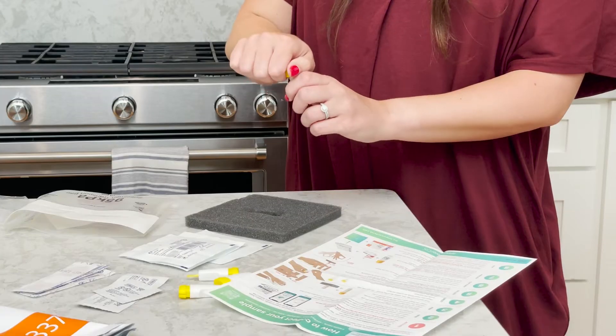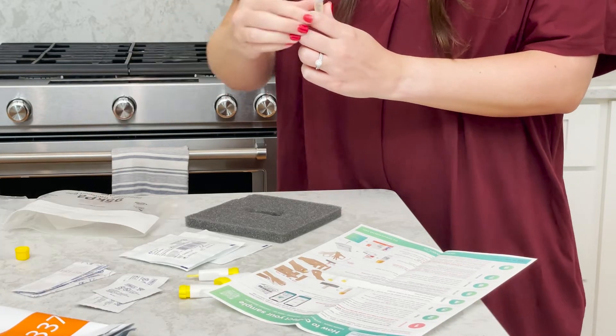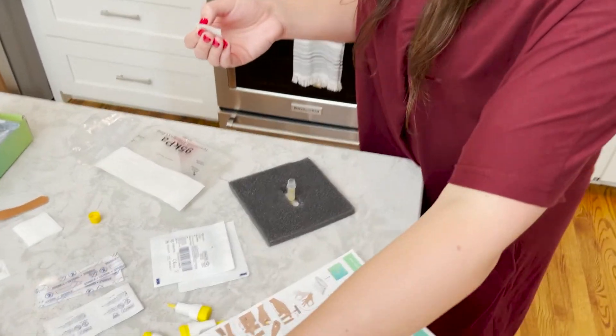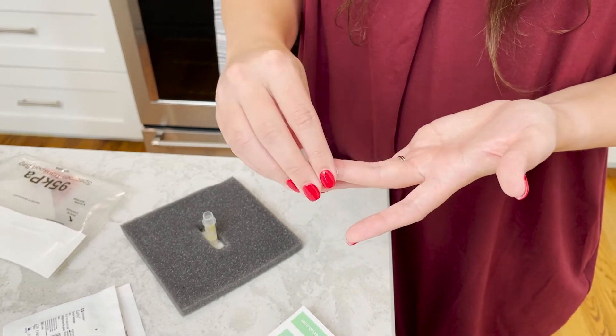Step 3: Prep. Remove the microtainer tube cap and place the cap open side up on a clean surface. Place the microtainer tube upright in the foam holder. Choose the side of your middle or ring finger, clean the finger with one alcohol swab, and let it dry.